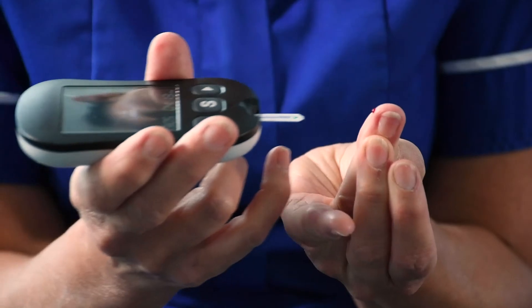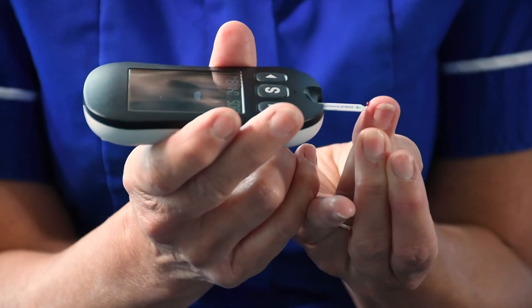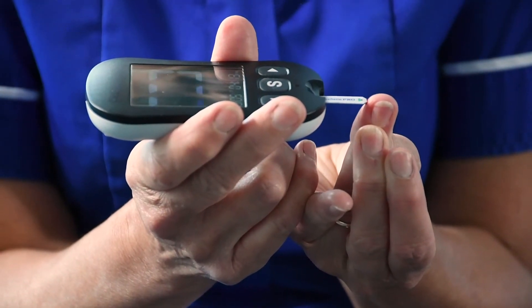Squeeze the tip of the finger until you see a blood drop. Take your meter and place the tip of the strip against the blood drop and hold it there for a few seconds until you hear the meter beep. The meter will then count down from five to zero and you will have your blood glucose reading displayed on the screen.